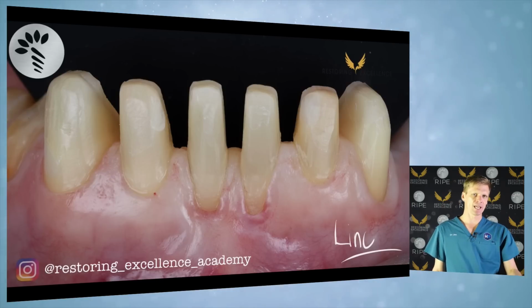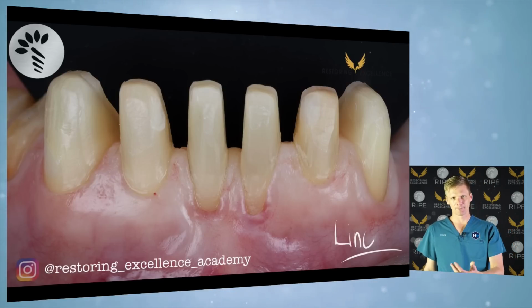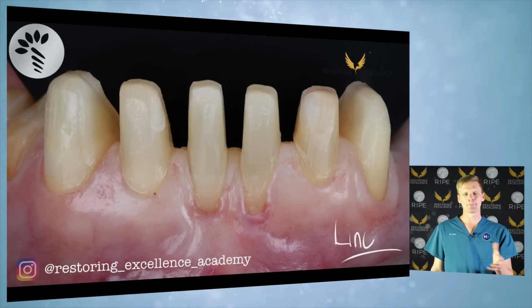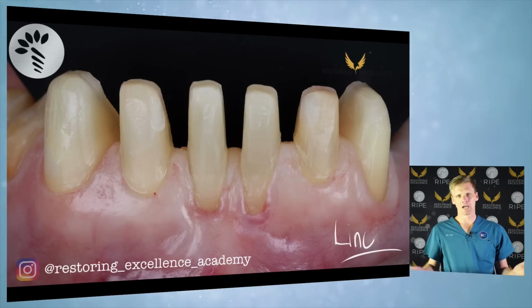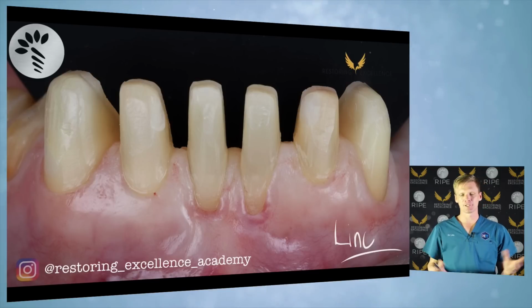If you're shiny, then you've got to sandblast them and roughen them up again to bond, because you lose some of your bonding strength when you've got super mirror shiny. And remember that your adhesive loses half its strength after a few years. So you want a little bit of resistance form and retention if you can get it.